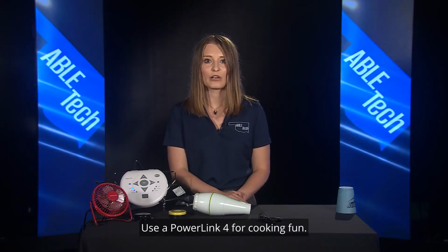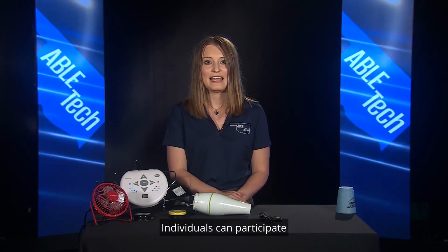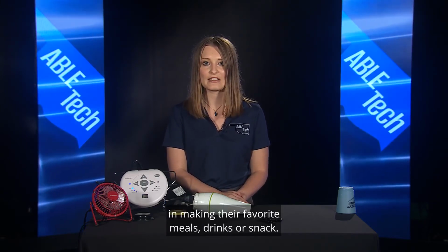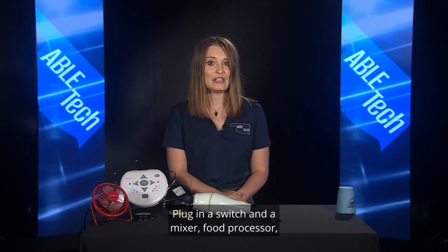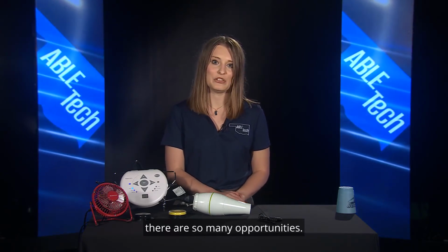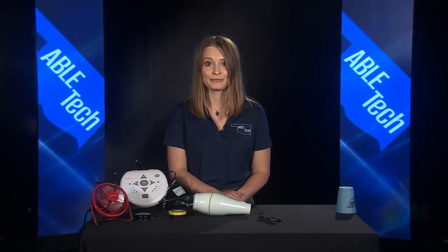Use a PowerLink 4 for cooking fun. Individuals can participate in making their favorite meals, drinks, or snack. Plug in a switch and a mixer, food processor, blender, ice cream maker, cotton candy machine, popcorn machine. There are so many opportunities. You can find so many more resources and ideas for switch activities at her YouTube account, Heidi Brislin.